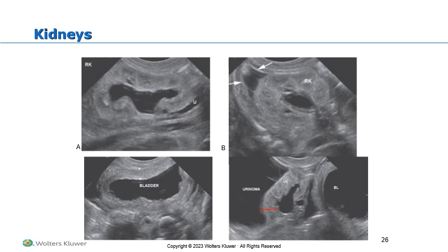Excuse me, this is the left kidney. Here's the bladder. The bladder wall is thickened. So we have a perinephric urinoma, or collection of fluid here, and we actually have ascites here, possibly another urinoma from leakage of the bladder.